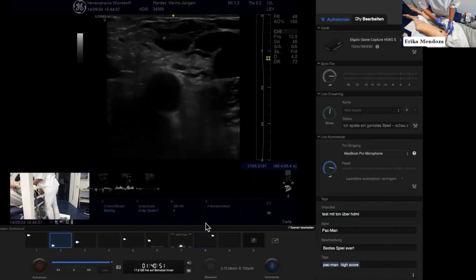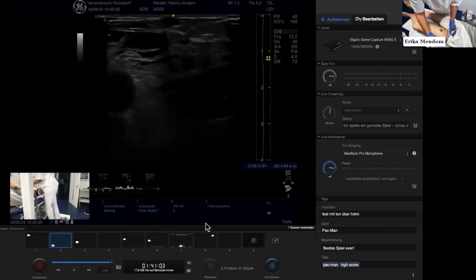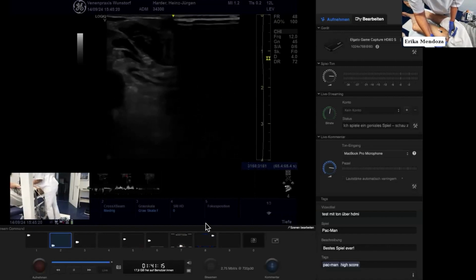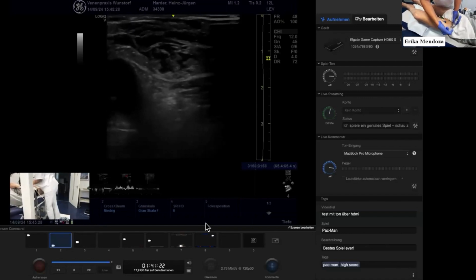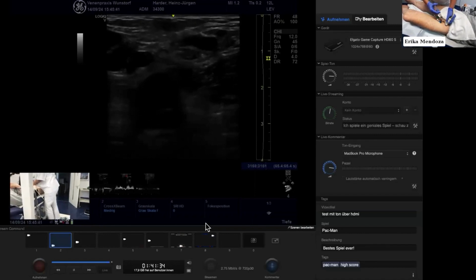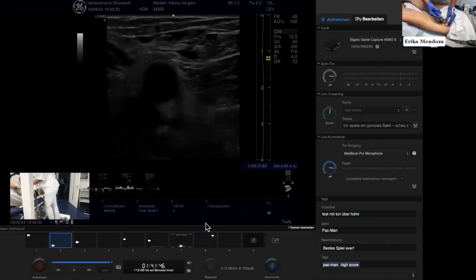Is this the same technique that you use, Joseph? Exactly the same technique. The only variations are vessel access size, whether I'm using a needle or an 18 gauge angiocath. I also add a tincture of xylocaine, just so it produces some anesthesia, and you also get vasoconstriction with the xylocaine as well. And I would use, on average, for a sclerotherapy session, anywhere from 200 to 500 mils of tumescence to achieve adequate compression. We all use it with endovenous laser ablation, but I think it's a shame that you don't take advantage of the same principles here with sclerotherapy.